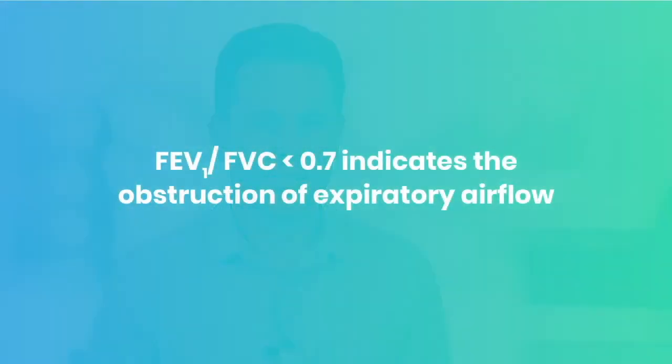And do you know how long it takes to get the rest out? So if 70% can be expired in 1 second, the rest usually takes around 6 seconds. If that ratio is less than 0.7, then that is consistent with airflow obstruction. Airflow obstruction means that there's something obstructing expiratory airflow. There's something slowing down the ability to get that air forcefully exhaled from the lungs.